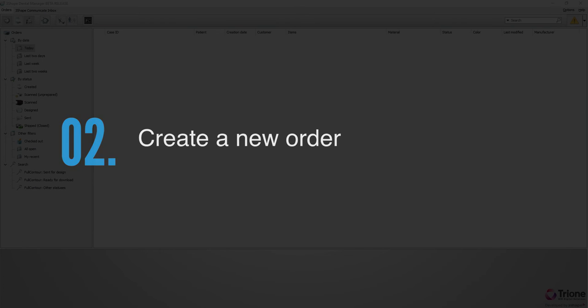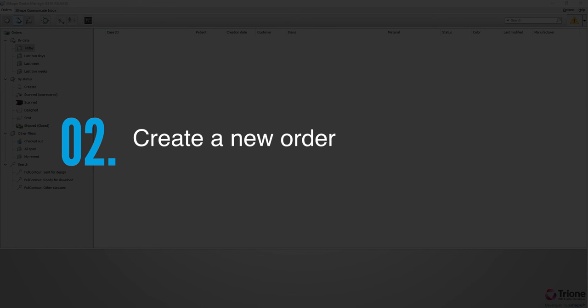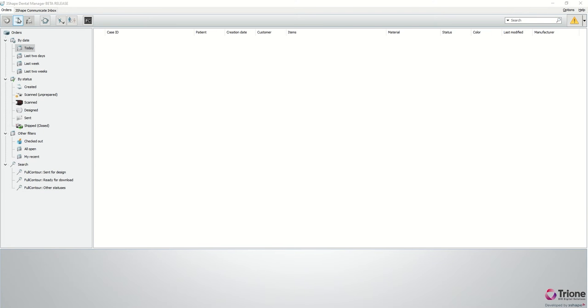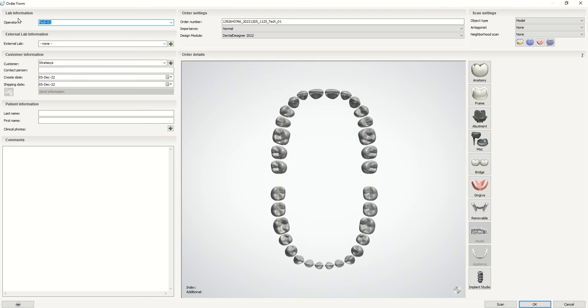Now start a new case as usual. After scanning a patient's mouth using an intraoral scanner, create a new order form.